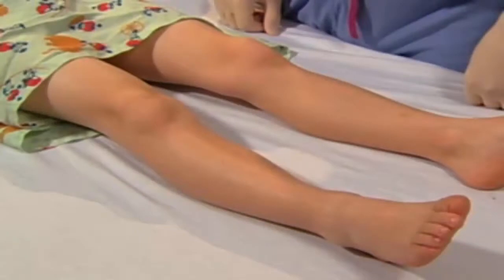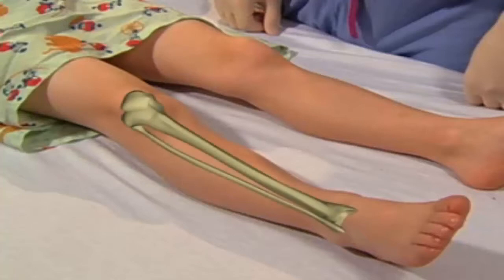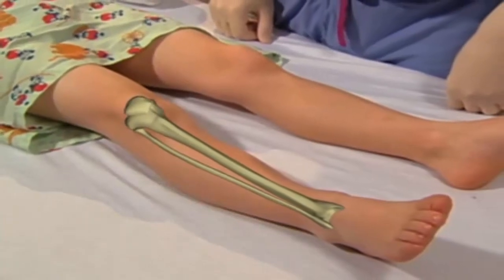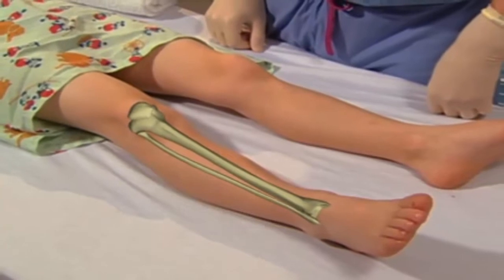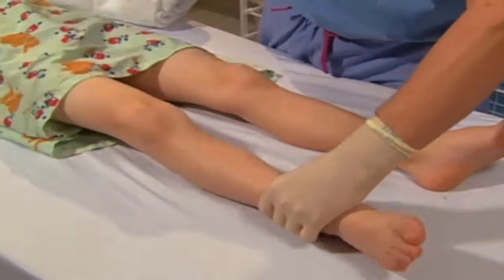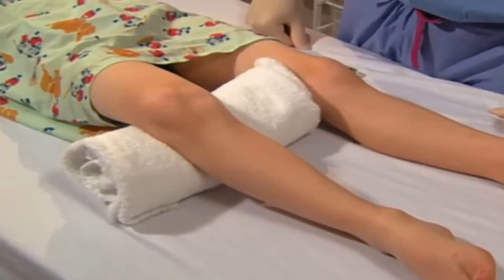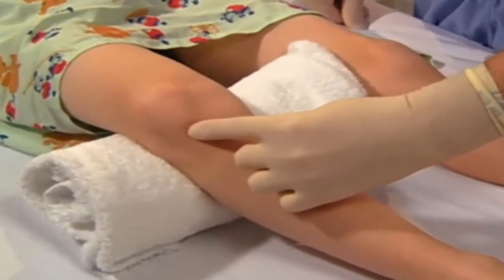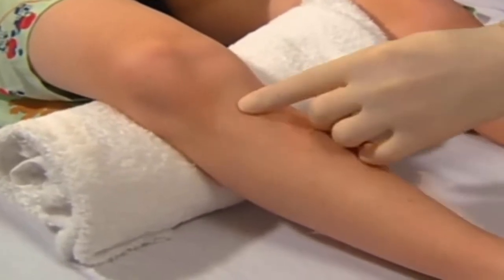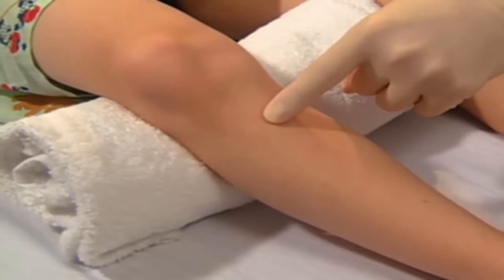The proximal tibia is the preferred site in children since palpation and identification of underlying bony landmarks is less likely to be obscured by large amounts of soft tissue. This location is also remote from the head and chest where airway management and chest compressions may be ongoing. Slight external rotation of the leg and placing a towel roll under the popliteal fossa may help flex the knee and maintain stability. Identify the lower pole of the patella; the prominence immediately below it is the tibial tuberosity. One to two centimeters inferior and medial to the tuberosity is the broad, flat surface of the tibia that serves as the targeted insertion site.